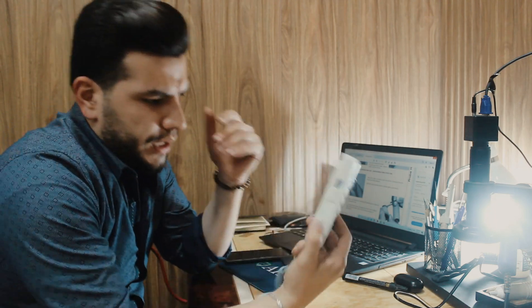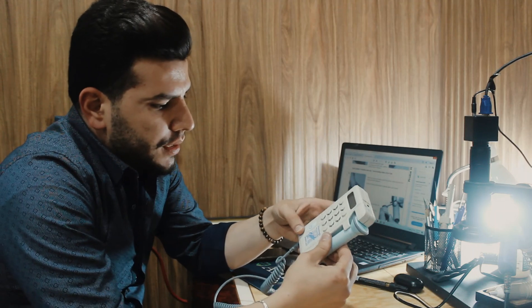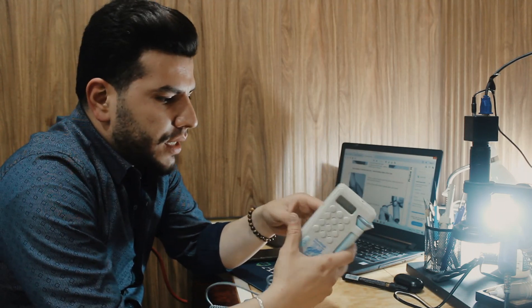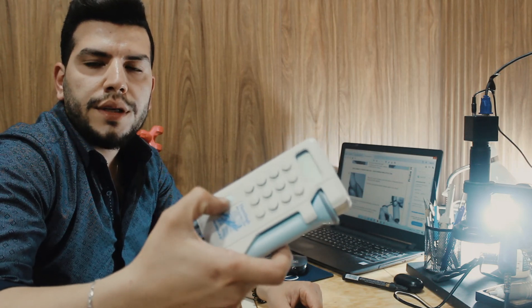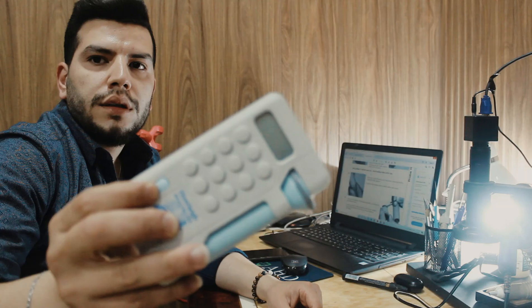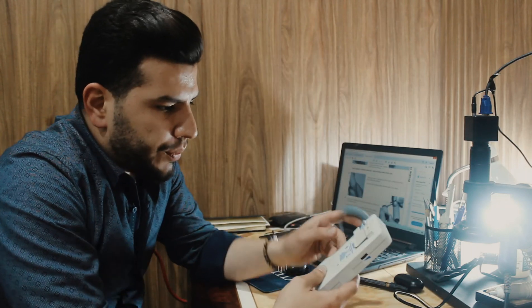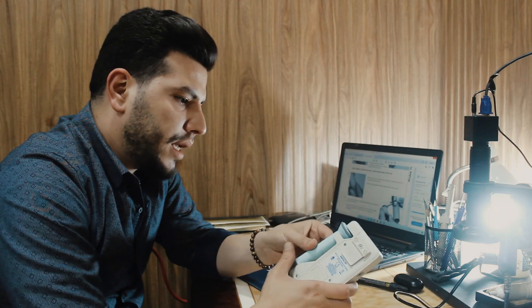Hi everyone. Today we received a Doppler device for fetal monitoring. The issue with this device is that it is not turning on. After we press the on/off button, there is nothing shown on the screen, as we can see here — nothing. So we need to open the cover to discover what caused this problem.